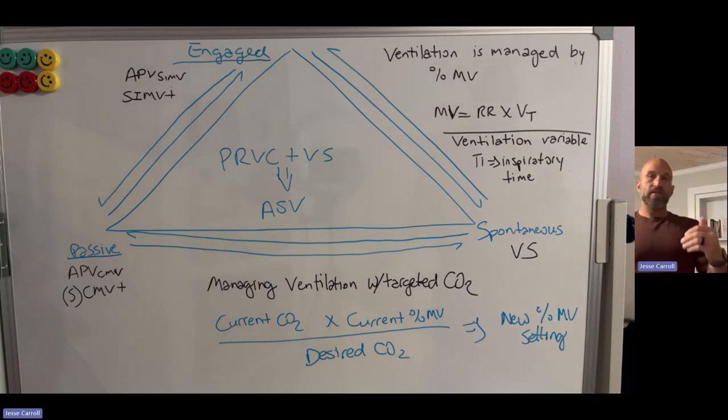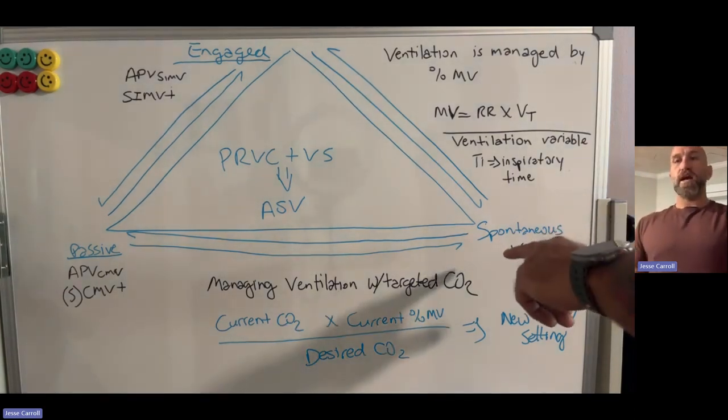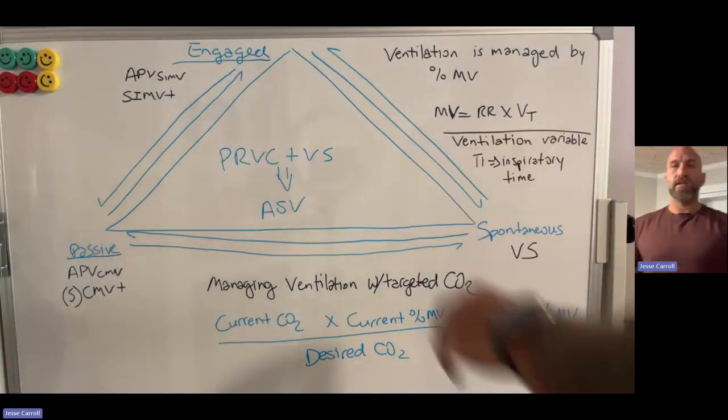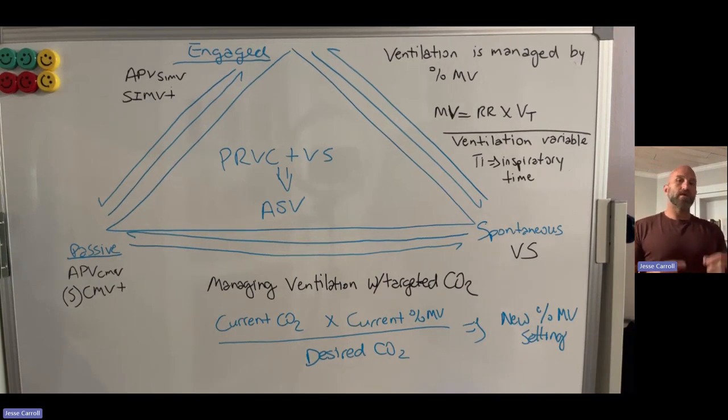What's unique about this style of closed loop ventilation in ASV is that when you move over to the spontaneous side of this paradigm, you're actually met with something that's very powerful, in that we get a volume supported spontaneous breath. And when that happens, the patient's spontaneous breathing now has its own targeted volume and augmenting pressures.